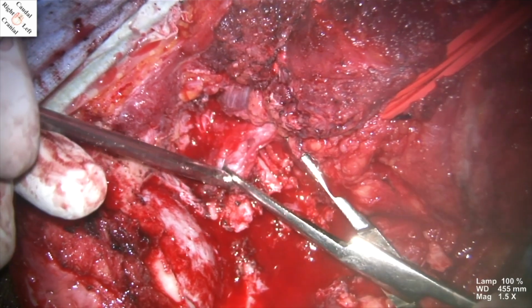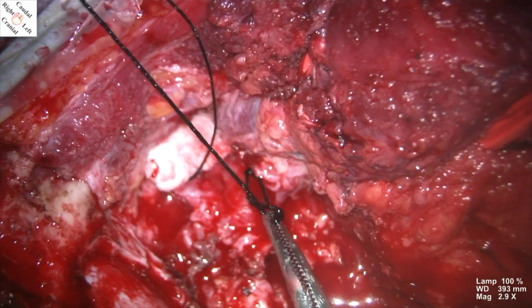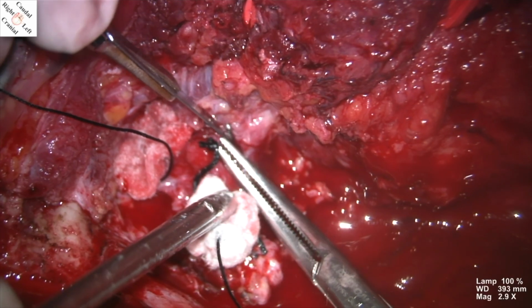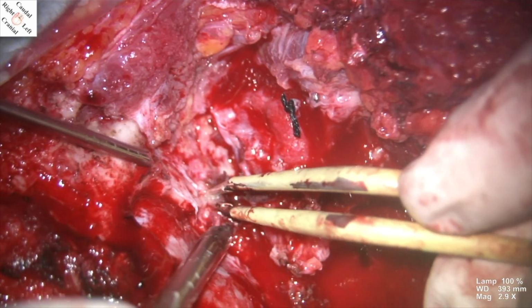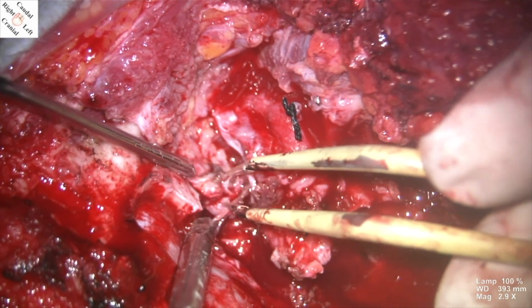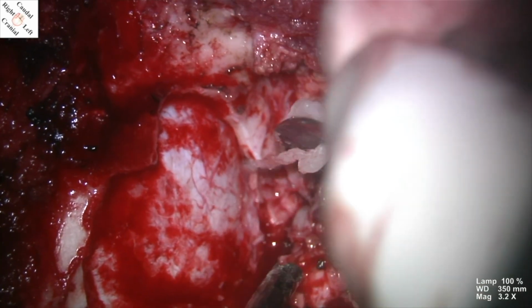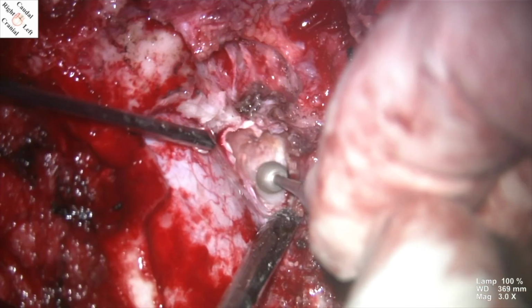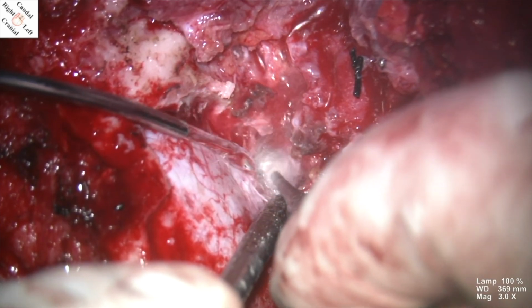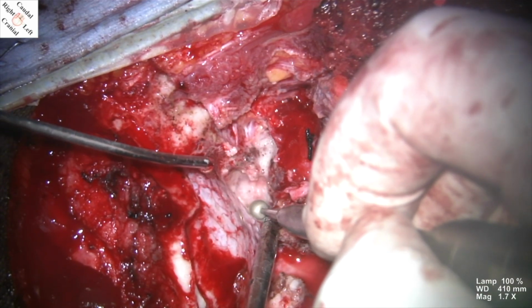The vertebral artery was dissected away from the extradural tumor and its muscular branch was identified, secured, and then divided. The residual extradural tumor located near the dorsal margin of foramen magnum was dissected. At this stage, bleeding from the condylar emissary vein was encountered and controlled with bone wax. The right-sided suboccipital craniotomy was extended laterally and inferiorly until the sigmoid sinus was visualized. Partial drilling of posterior one-third of right occipital condyle was performed.